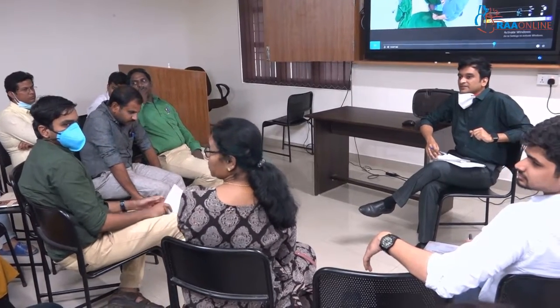I would go ahead with the second laryngoscopy. I would mask ventilate. In case the second attempt is going to be difficult, at least it will be a saving. Okay. So I think that's the final consensus probably, because it's a future event, a probability, that's what she's saying. There is a probability of desaturation. Okay, so we are going to reduce that probability to nearly zero by mask ventilation.